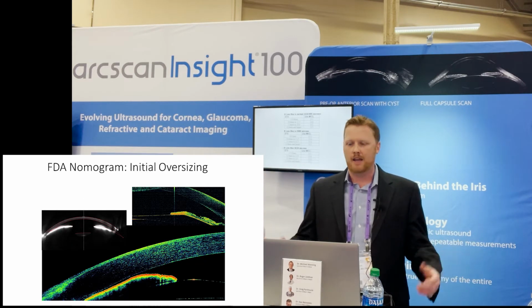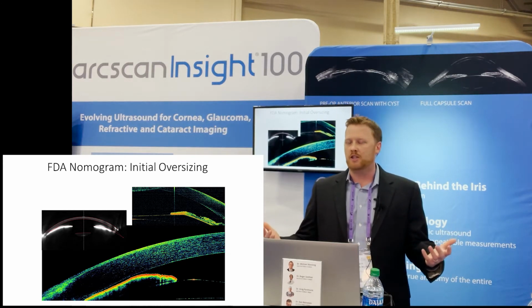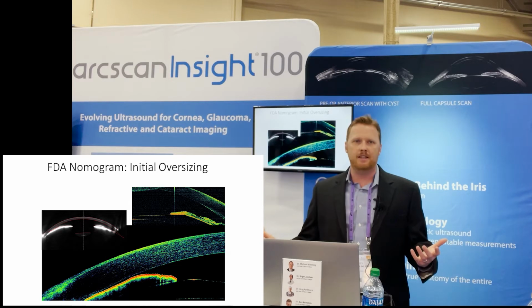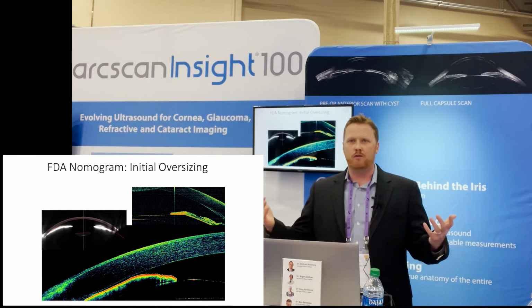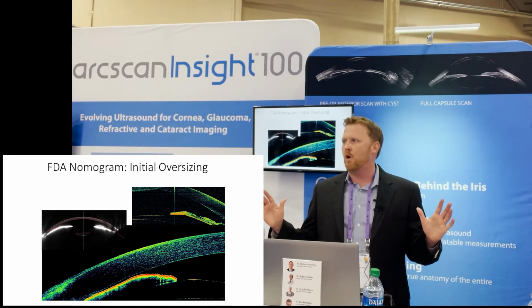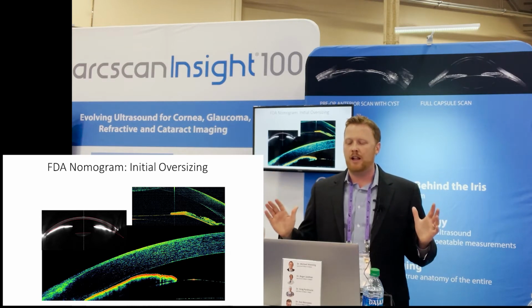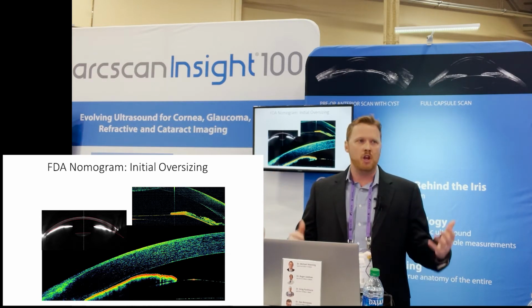It's the outliers. And that is what can keep surgeons from wanting to do this. You get that one patient, you put in that ICL, and they have a huge vault, and now they're in angle closure. That one patient can make you say, you know what, I'm not doing ICLs anymore, because I do not want to deal with these, because they can be really difficult and challenging situations surgically. And you have a young patient too.